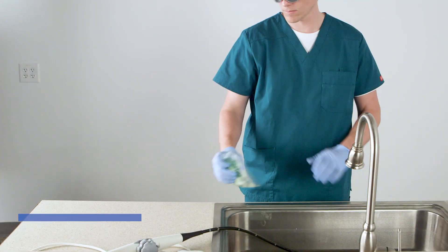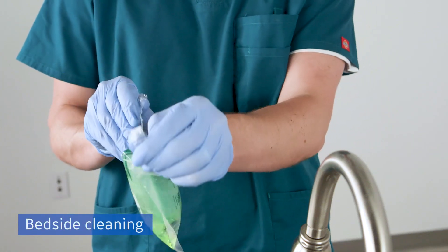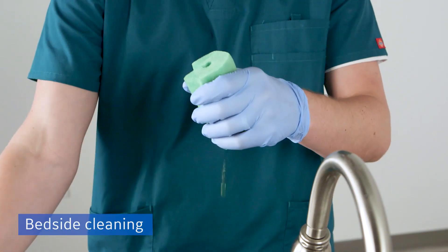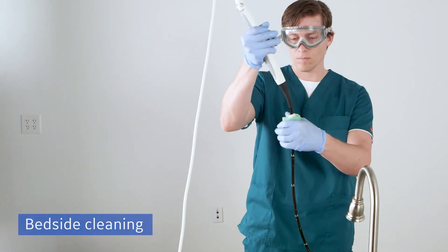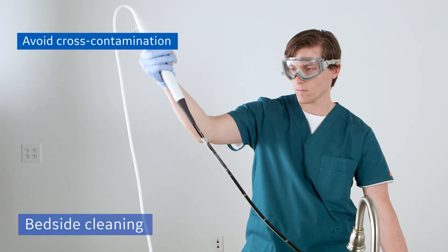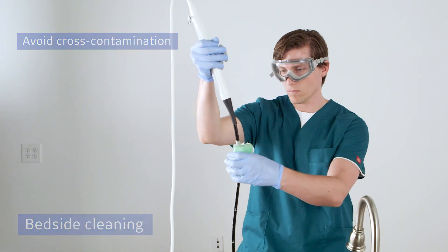Bedside cleaning is an important step in the disinfection process. Because patient fluids can lead to biofilm buildup, the pre-soaked enzymatic sponge should be used as soon as the TEE probe is removed from the patient. To avoid cross contamination, each sponge is individually packaged for a single use.